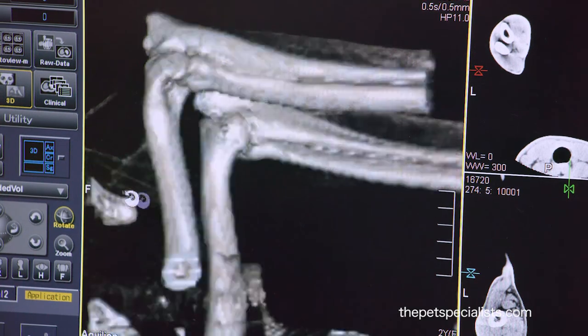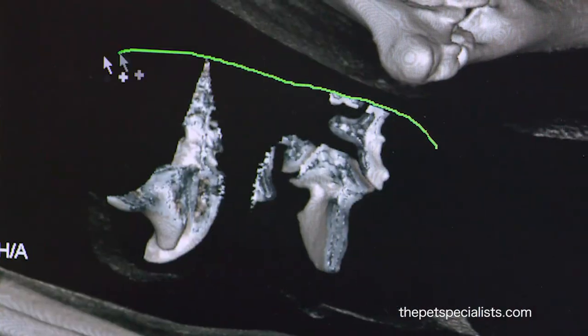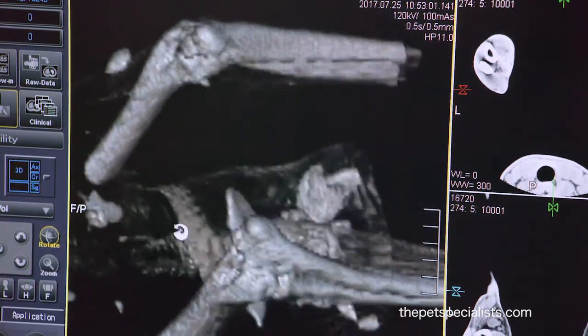We've created a three-dimensional image of just the elbows. We've been able to remove any other bone and soft tissue, and now we can look at this in any plane that we want.